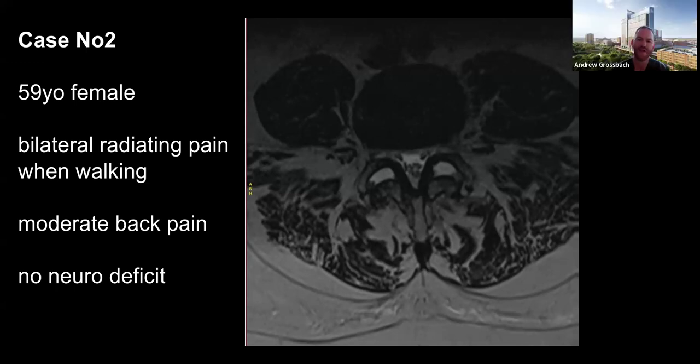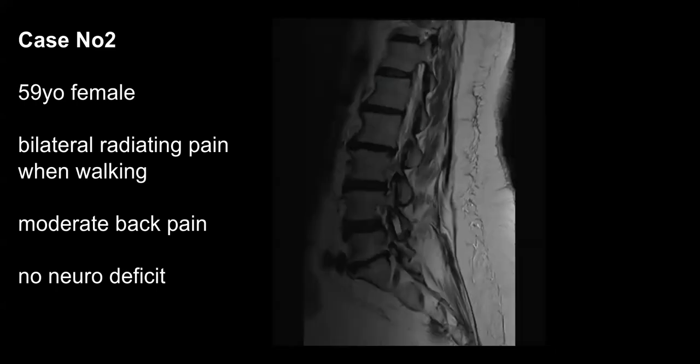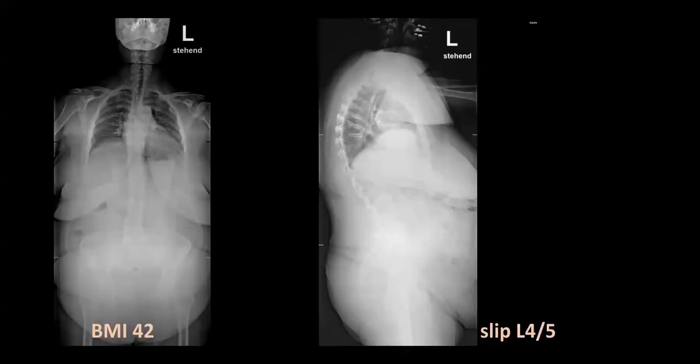So was there a sagittal view? So this is the mid-sag. This is a little bit parasagittal, and this is the axial view. You won't find any axial view with more compression than this. So the spinal canal is free. There's no compression. I want to see some upright X-rays. I usually get flexion extension views, but I think supine MRI to an upright X-ray usually tells me as much information as I need. So I give it to you.